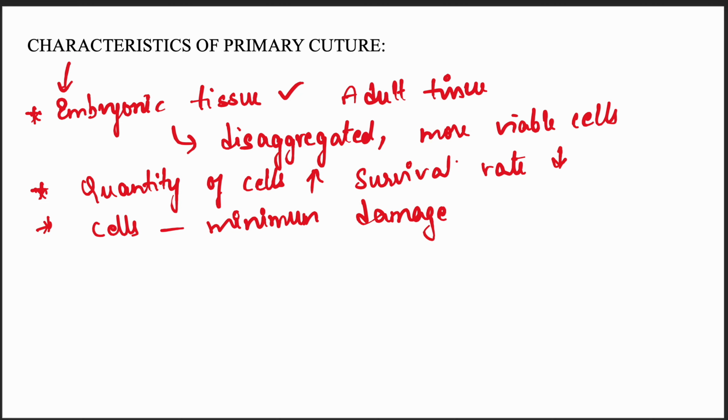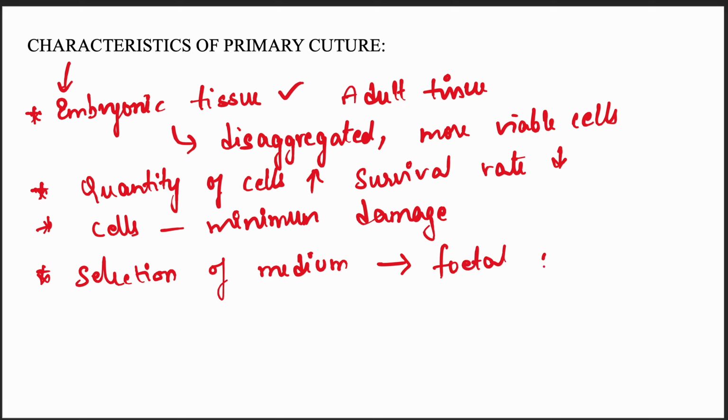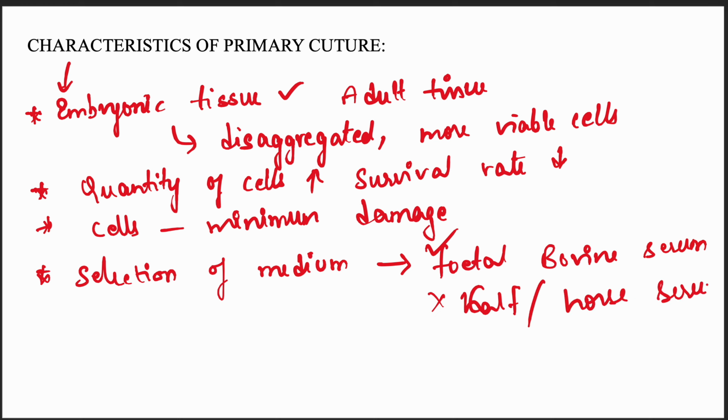Okay. And the selection of media is also important. With serum and without serum, we consider the selection of media to be important. Mostly with serum, we prefer fetal bovine serum. Here calf serum or horse serum is not preferred.